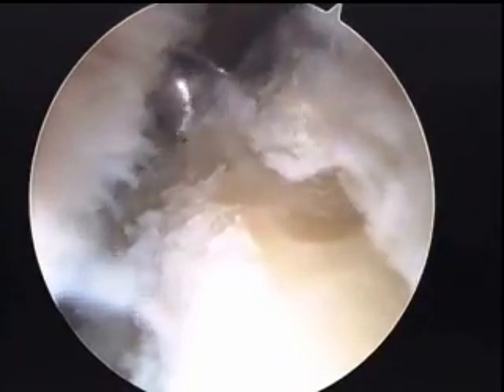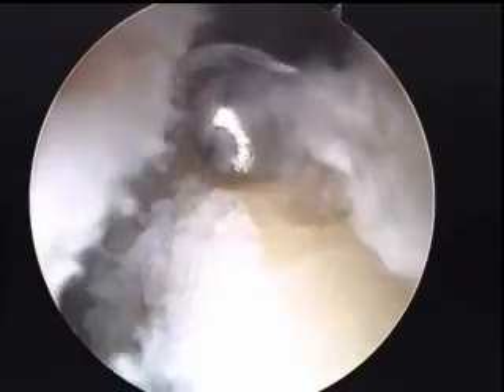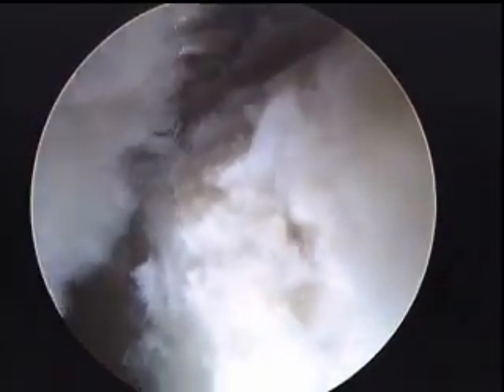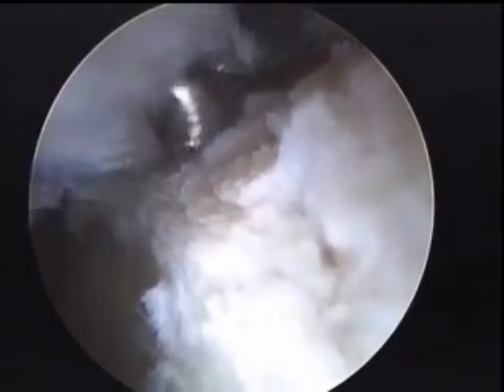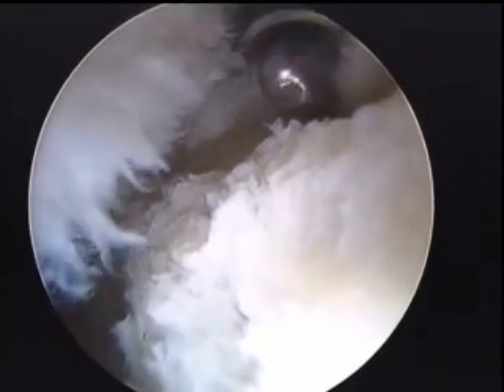This is about a 4.5mm burr, so we're taking about 4mm off. It looks like we've brought the rim down to where more of the stable cartilage is, and all the unstable cartilage above that we've removed previously with our other instruments.